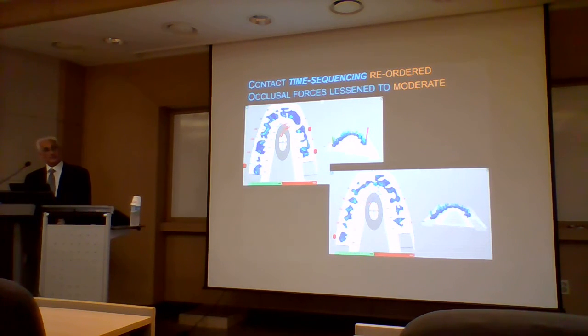How to instruct the patient: just close, just bite. Bite down and hold. They have two bites. And then you can look at the sequencing of when they close, and the time delayed end result is actually longer than the first. The first recording is shorter in time than the second one, because the delay allows the implants to come together later. So it's about 1/10 of a second difference. 1/10 of a second. Yes.